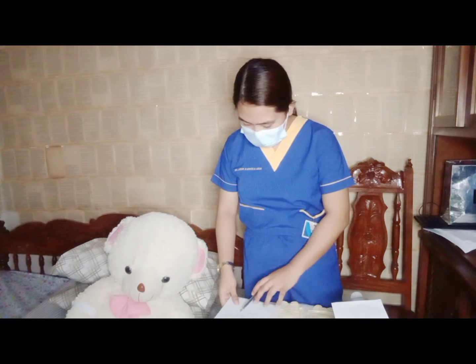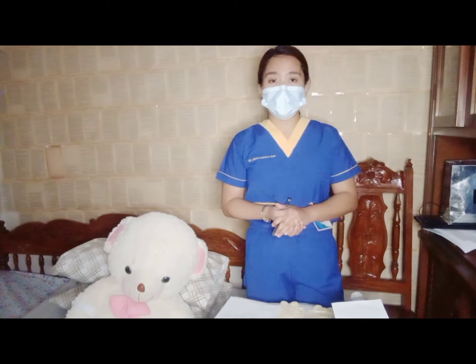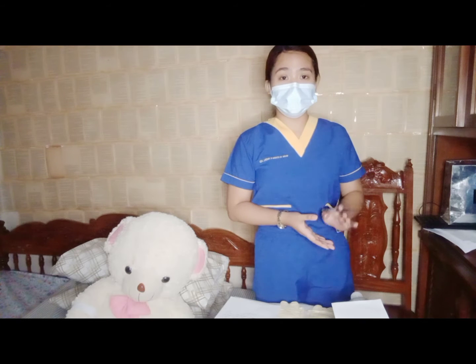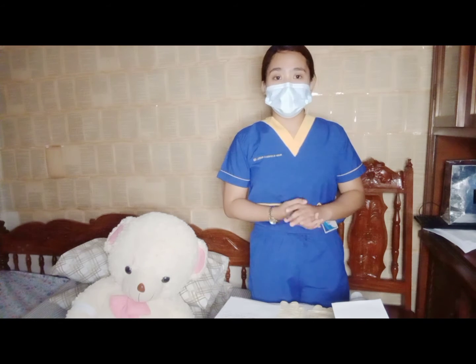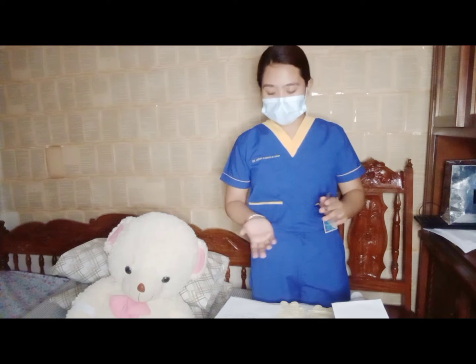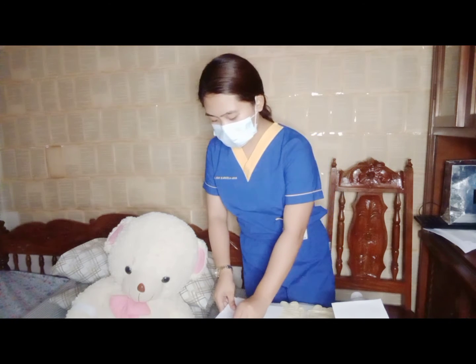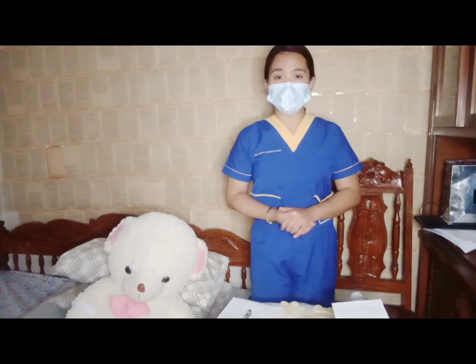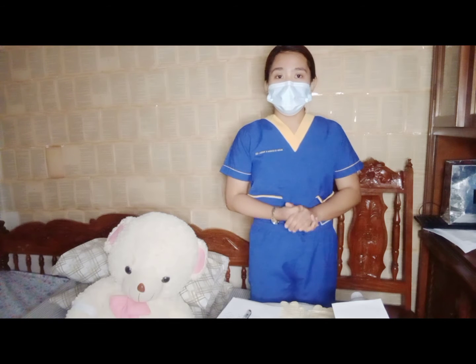And then, inspect blood product for clots. We need to inspect the blood product for clots. If a clot is present, we need to return it to the blood bank and obtain a new blood product which is of course compatible for the patient. Okay. So, the identity check between the patient and the blood component is very crucial.